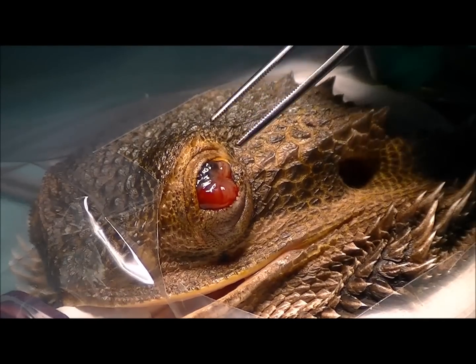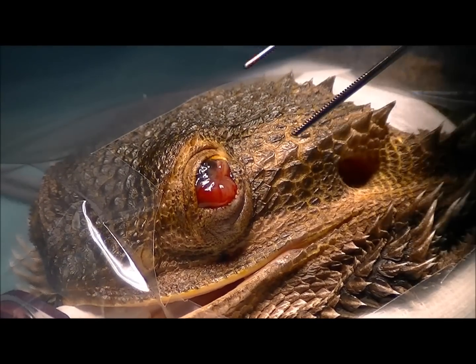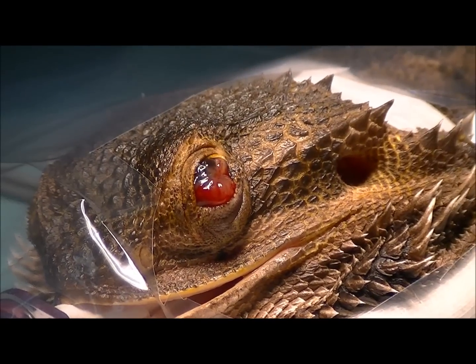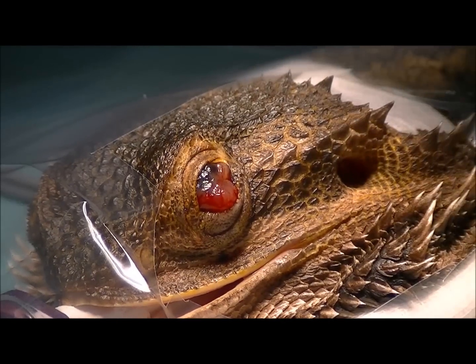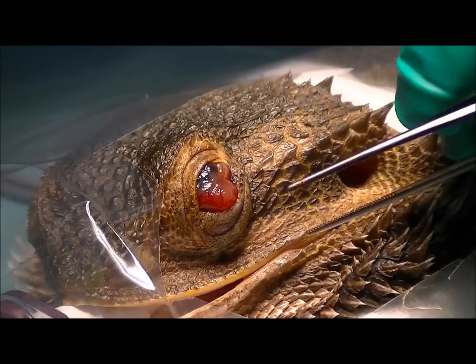We've got Jack anaesthetised now and hooked up to our ventilator, so you'll hear that soft clicking noise in the background — that's the ventilator breathing for her. We've also got what's called a pulse doppler on her heart, and that swooshing noise you hear in the background is actually her heartbeat.